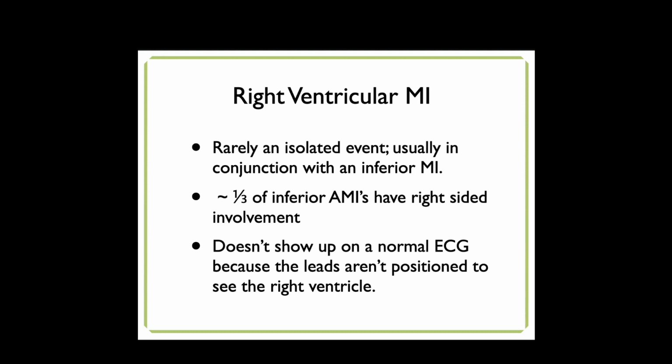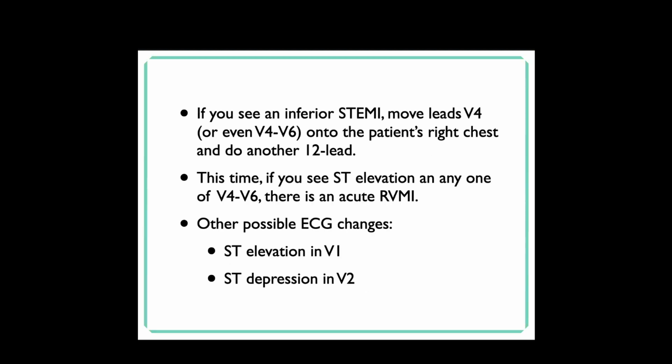Okay. The right-sided MI, or the right ventricular MI, doesn't show up as ST elevation on a normal ECG because all of the electrodes are on the left side. So you just don't see it. Okay. So now, it depends on your protocol. This particular slide refers to a particular protocol, but you might not necessarily work under that.